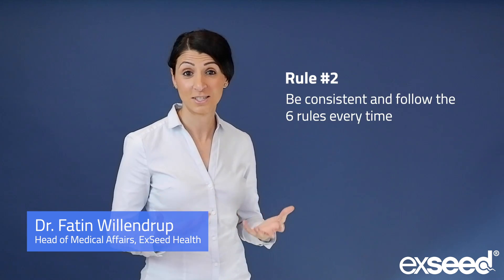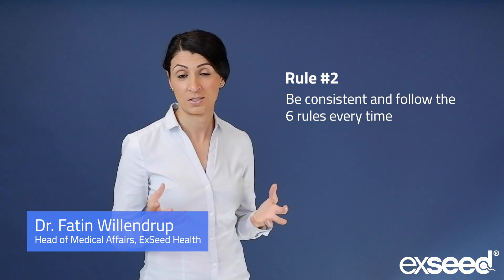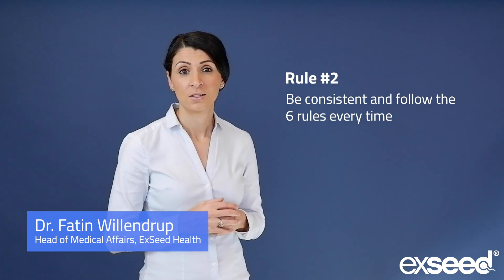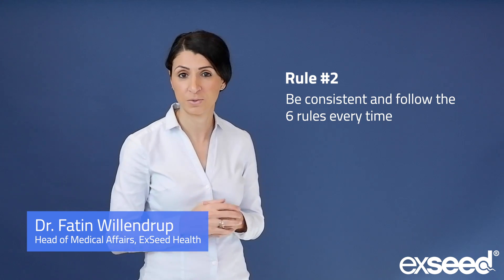Rule number two: be consistent. You need to follow these six rules every time you test with the exceed device. This allows your results to be most accurate and also to be compared from time to time.